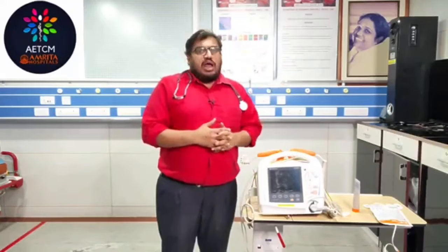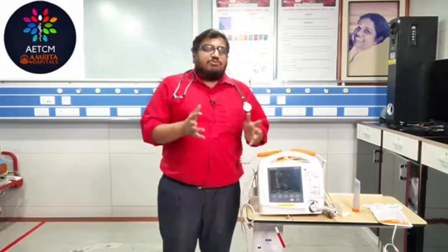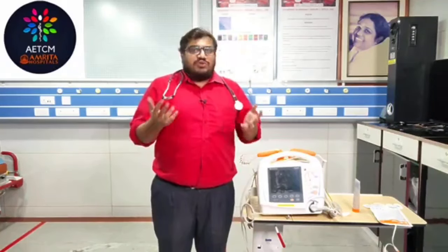The defibrillator was invented somewhere in the 1950s. At that time, they tried to revert ventricular fibrillation and found it successful, and from 1960 onwards they identified the use of direct cardioversion. So that is the history of the defibrillator. Basically, defibrillators are divided into two or three types. You can have a biphasic defibrillator and a monophasic defibrillator.